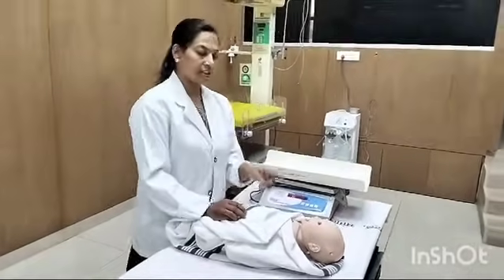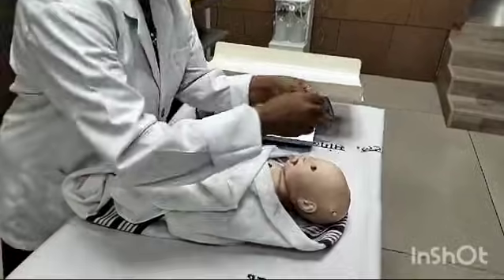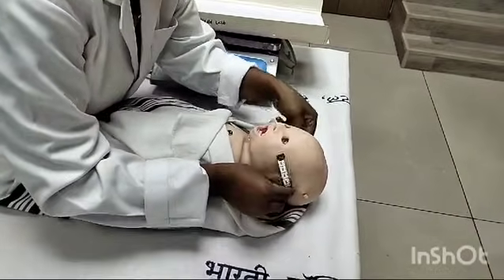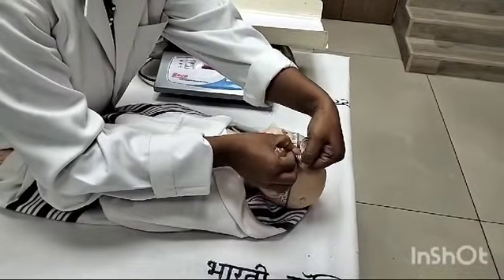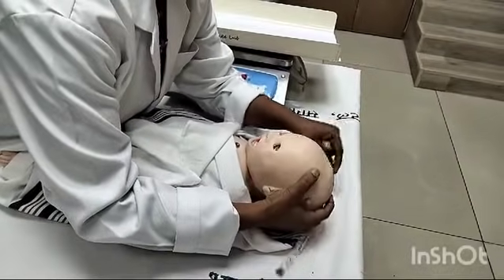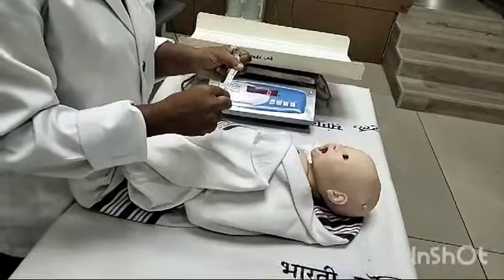Especially first we need to take the head circumference of the baby. Take the measuring tape on the centimeter side, hold the baby's head at the occipital prominences, keep the measuring tape on the occipital prominences and above the eyebrows, and measure the head circumference in centimeters. When removing the measuring tape, don't pull it, because the baby's skin is very delicate and the baby may get injured.